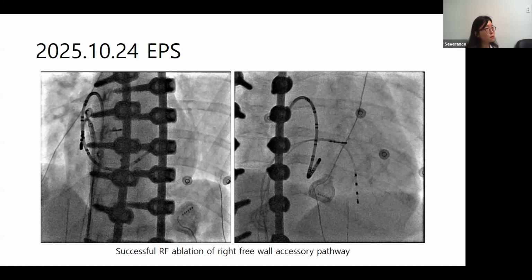So with V pacing and A pacing, you can estimate which point is closest. And of course, if you want to make just one shot, one kill, that terminology became very popular in KHRS. Single ablation, you want success, so look for the accessory pathway. That is the key.